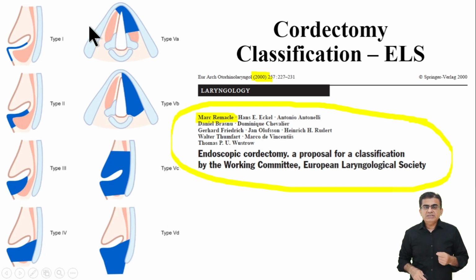In traditional open surgery, we simply remove large predefined anatomical compartments. But in transoral laser microsurgery, our approach is totally different. We must carefully tailor our surgical cut perfectly to the tumor's exact depth and surface area.